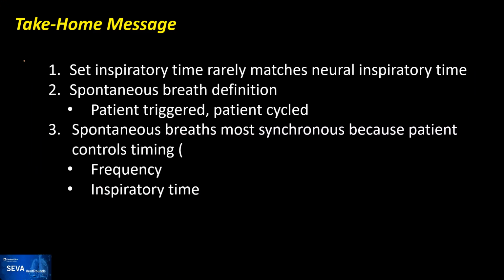Any machine involvement makes the breath a mandatory one. And lastly, spontaneous breaths are the most synchronous because the patient controls when they start and when they finish. Nobody is deciding when they start, there's no set variation in the flow rate, and nobody is saying when they finish. Everything is under the control of the patient.